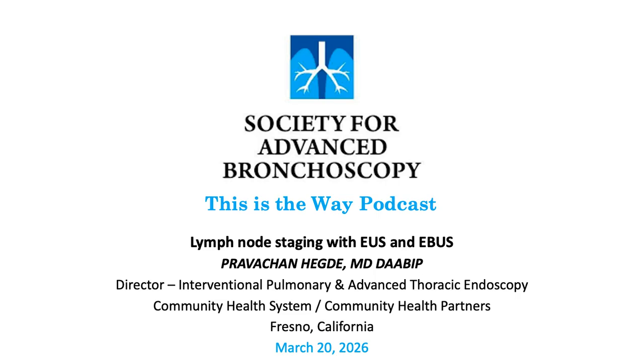So we first identify the liver, then the aorta, and then the left adrenal, and station 7, 4L, and 4R, and then try finding them in order. And with IP and advanced bronchoscopy knowledge of mediastinal anatomy, the learning curve is short.